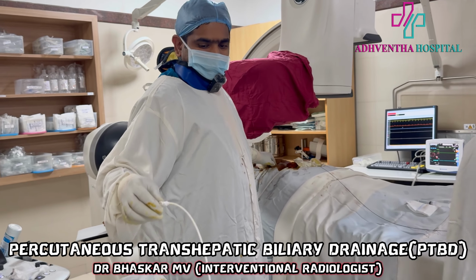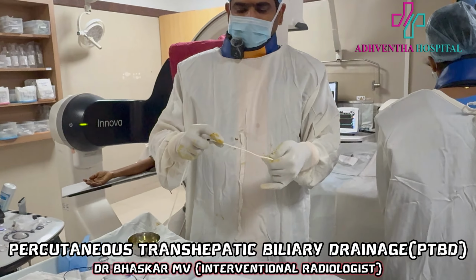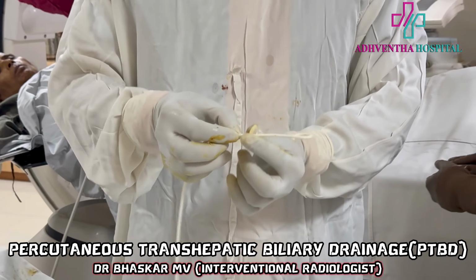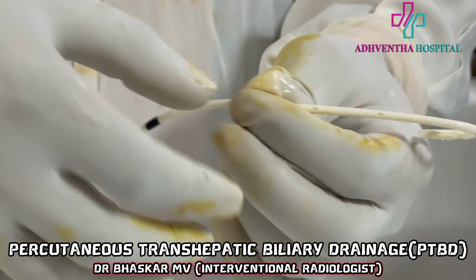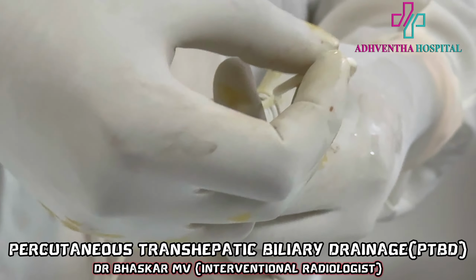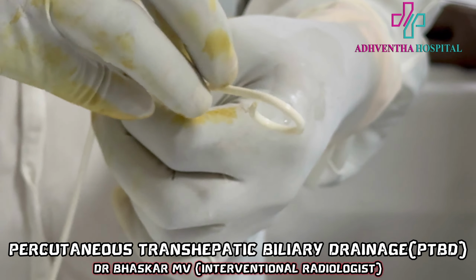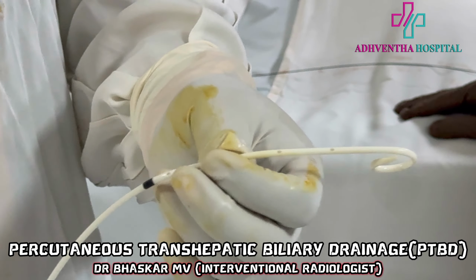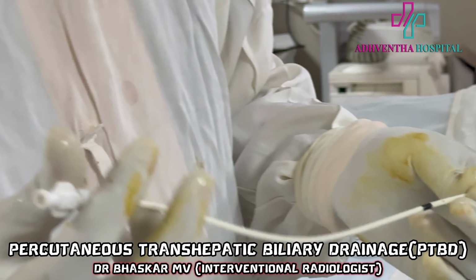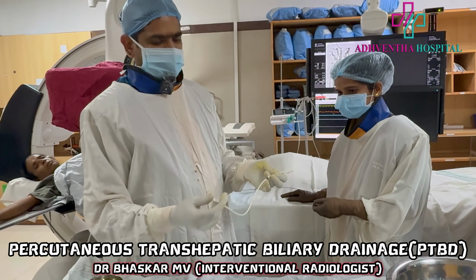So now this is the multi-hole catheter. You can appreciate many holes will be there before the obstruction, and the tip will be there in the duodenum. So now it acts as a bridge, so that the obstruction will be bypassed. So internal drainage also will be there, and one more external drainage. Whenever obstruction occurs, you can aspirate, or sometimes it will come out here.